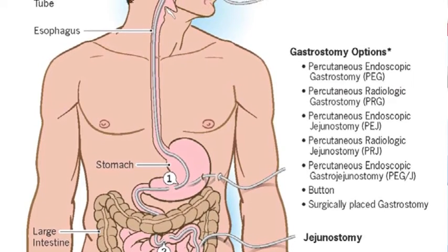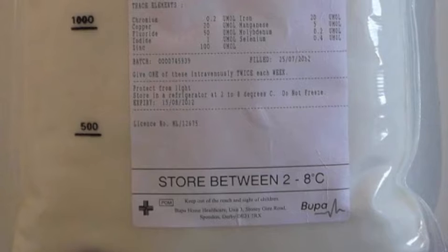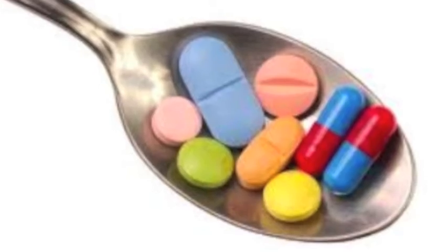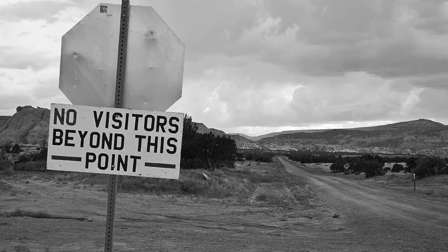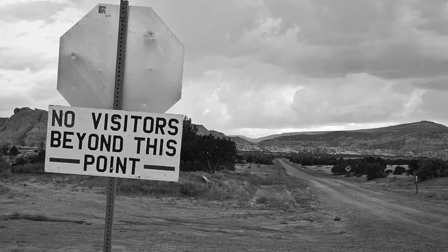Registered nurses are principally responsible for providing the daily care of NGTs, as well as the administration of nutritional formulas and the installation of medication and other substances. Due to the invasive nature of the placement process, it is generally not advisable to have visitors present during placement or removal of the NGT.